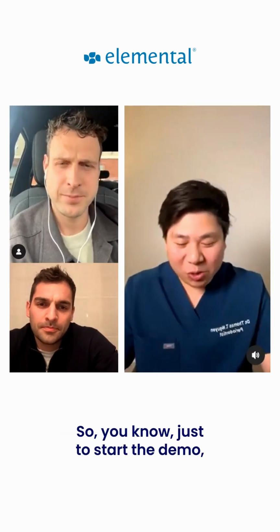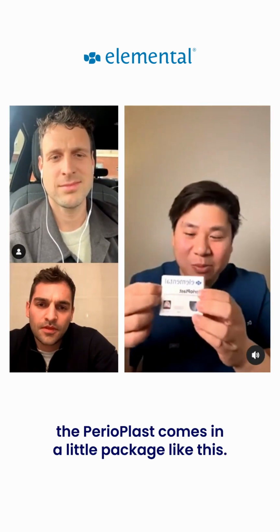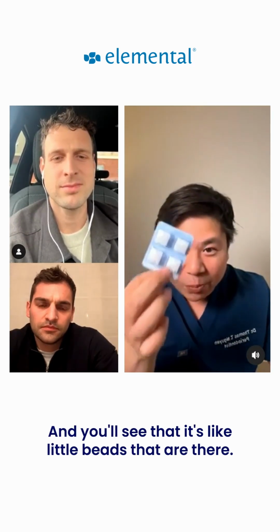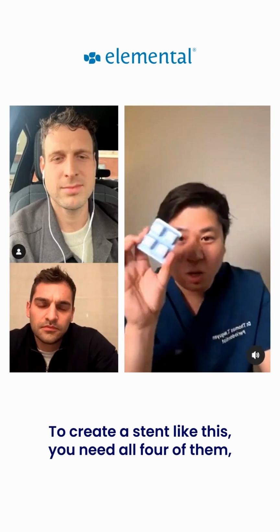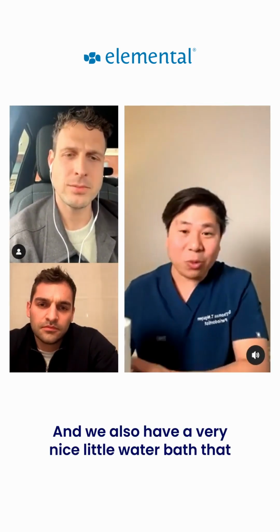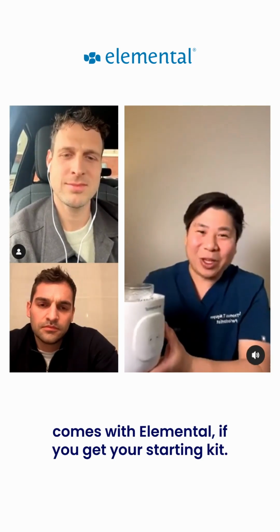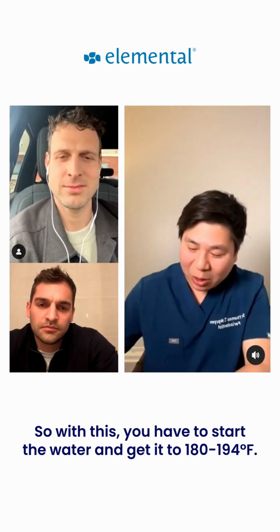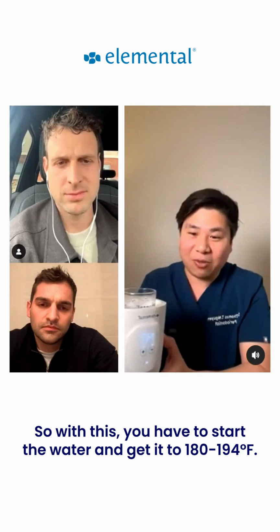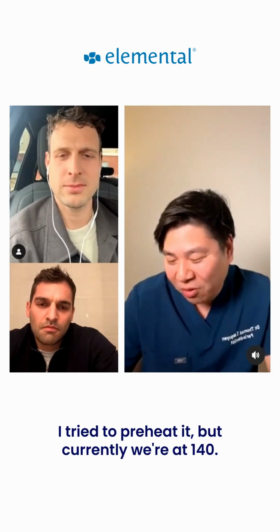So, just to start the demo, the Perioplast comes in a little package like this, and you'll see that there are little beads. To create a stent like this, you need all four of them. So it's not for four stents, but all of this is to make one. And we also have a very nice little water bath that comes with Elemental if you get your starting kit. With this, you have to start the water and get it to 194 Fahrenheit. I tried to preheat it, but currently we're at 140.